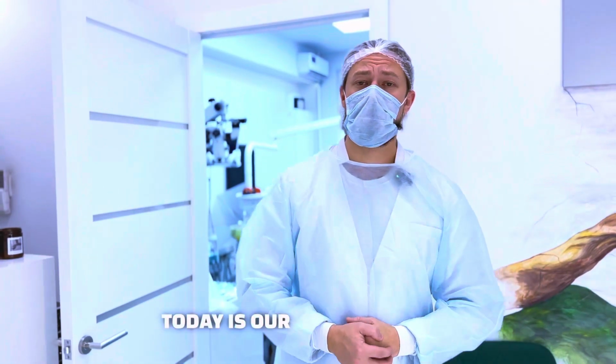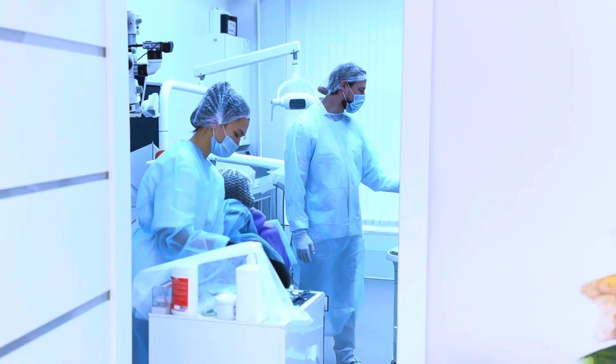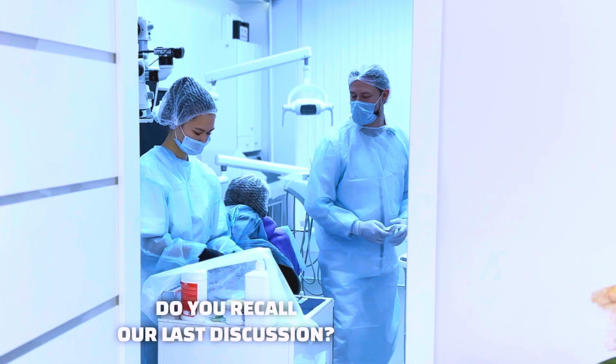Good morning, everyone. Today is our surgical day for implant installment. The patient is prepared. Let's proceed. We initially agreed on 3 implants. Do you recall our last discussion?